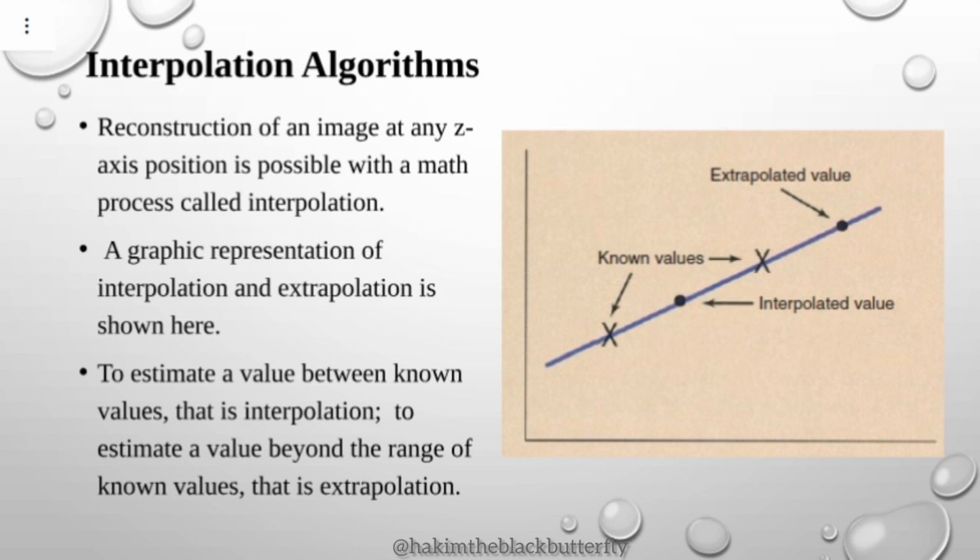Even how the images are reconstructed and displayed on the computer, it is all mathematics that plays the biggest part. There's no mathematics in conventional radiography. But in CT, every problem associated with it is a mathematical problem. The software is all mathematics.